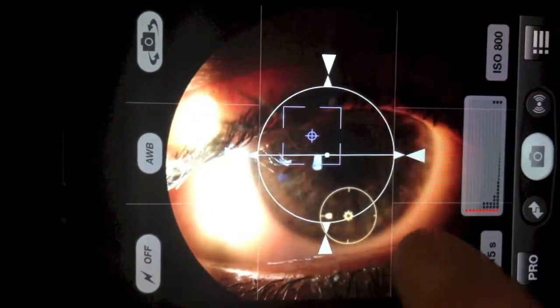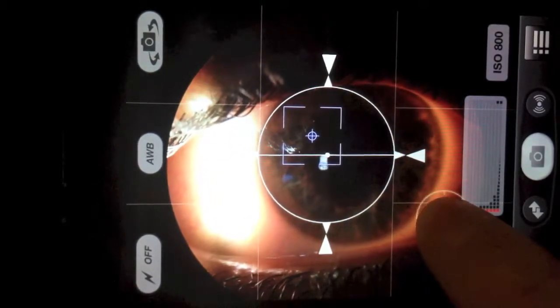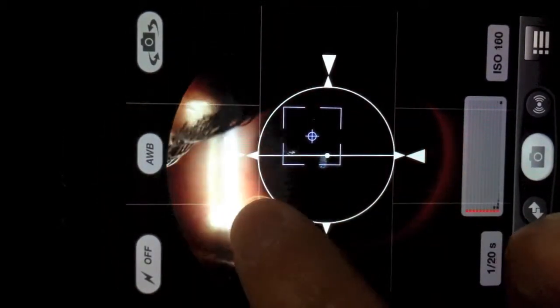Fourth, optimize the lighting by moving the yellow exposure circle left and right.